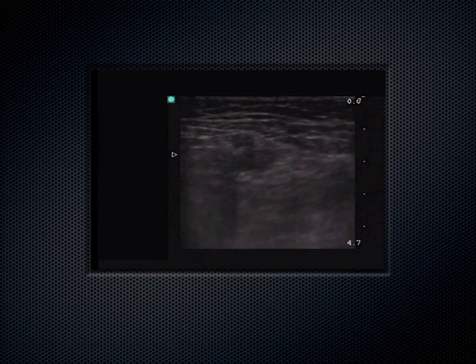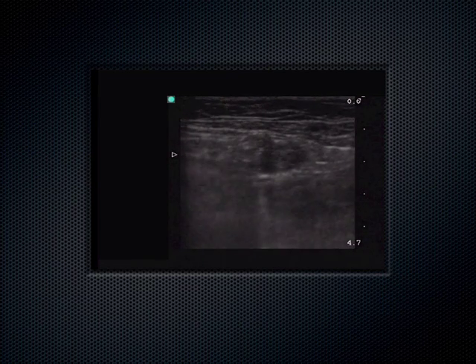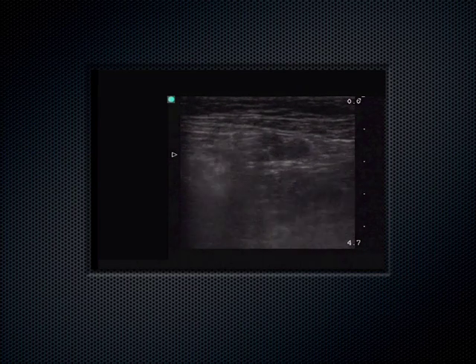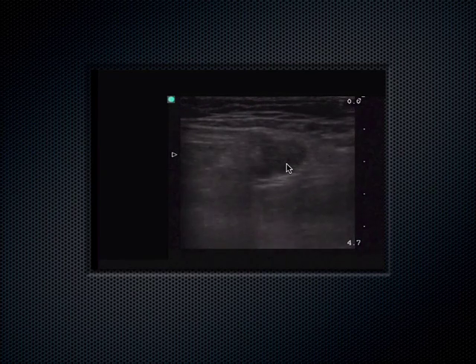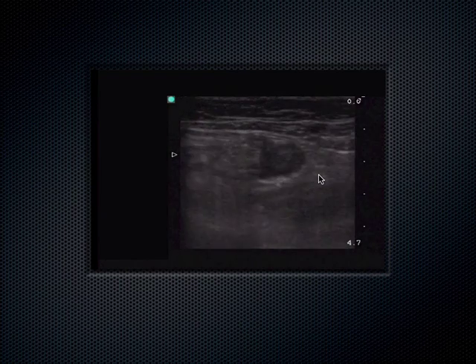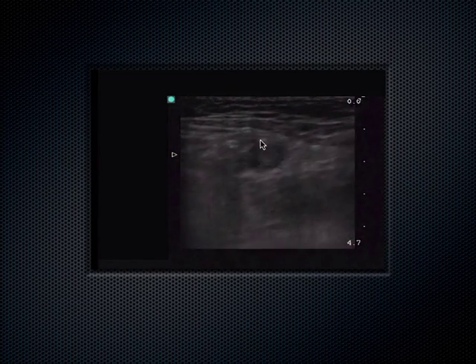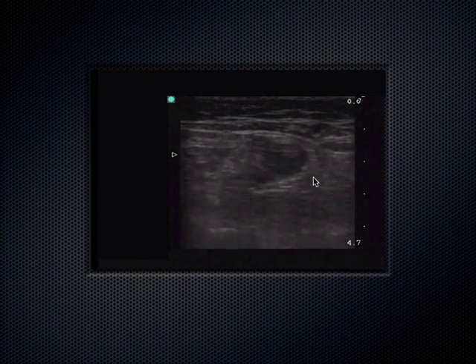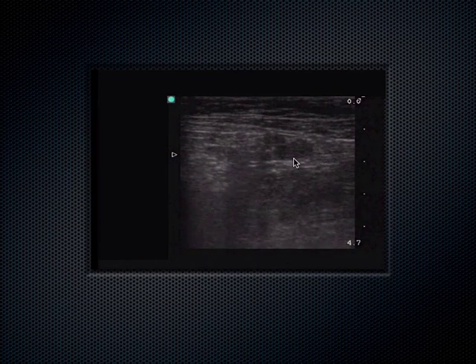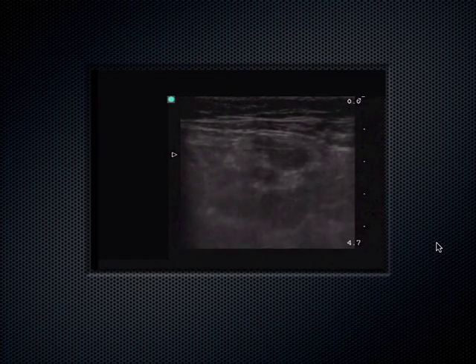What do we see here? Not compressible. So there's DVT where? Right leg. So this is the femoral artery up here. She's a little tiny thing. This is her femoral artery up here, and this is her femoral vein right here. And once in a while, boom, it's not compressible right there. It's not compressible. Now, technique-wise, yeah, definitely. Decrease this depth, maximize your screen real estate, maybe turn the gain up a little bit.